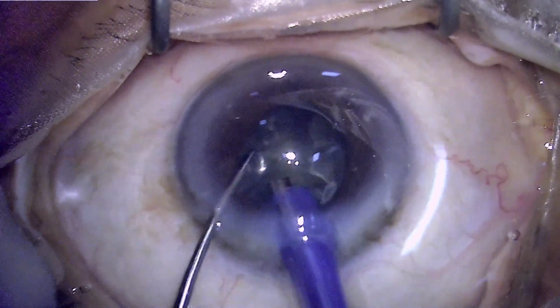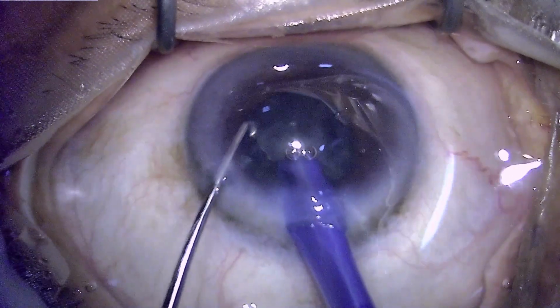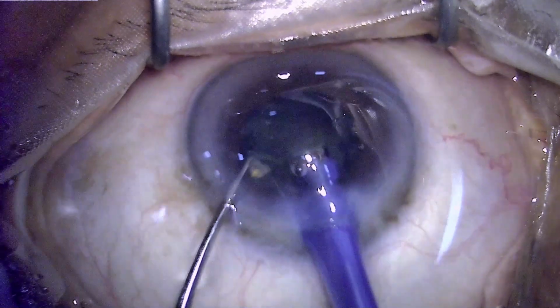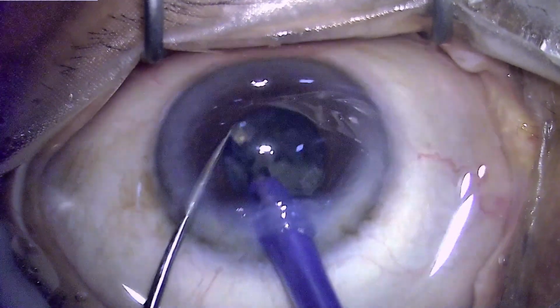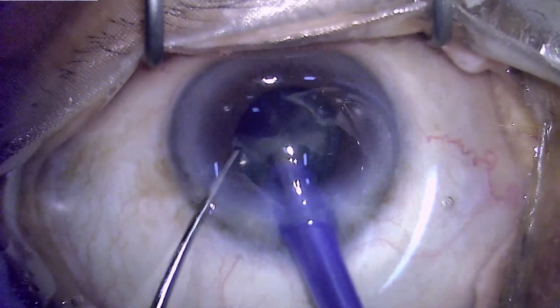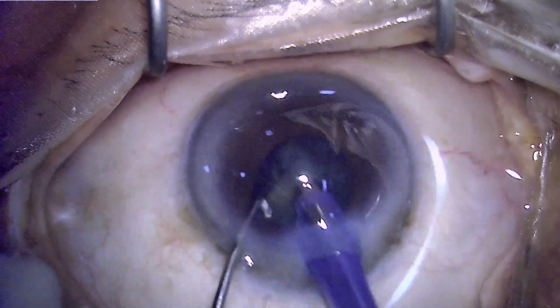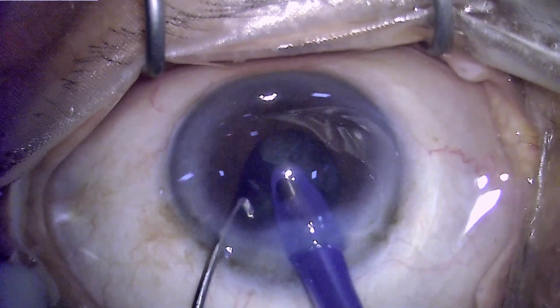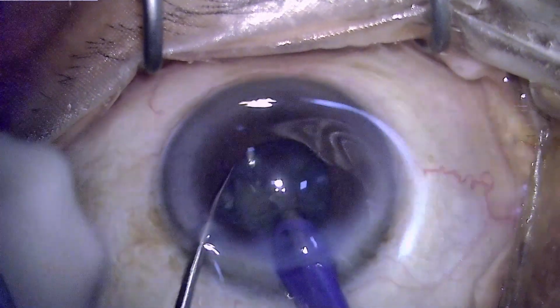Once the chopping has been completed, we can proceed to picking up each piece and emulsifying it. As required, we can chop them as and when needed if the size is large. So the chopping of these pieces into smaller pieces can be done in one go, or they can be chopped separately, one by one, as they come to the handpiece.